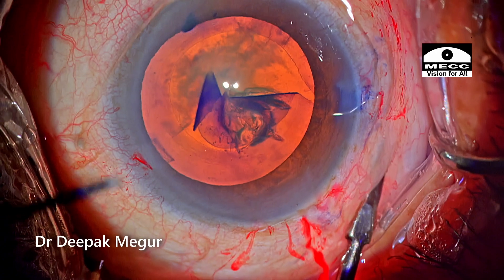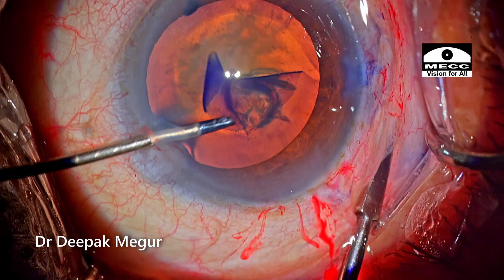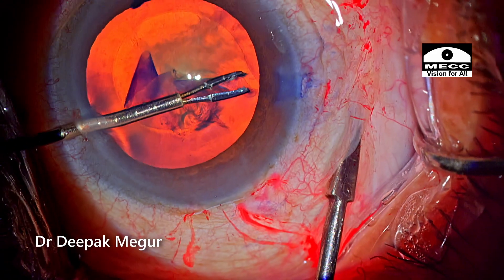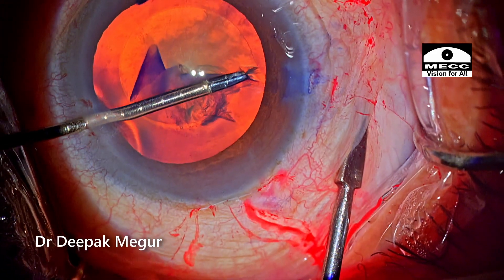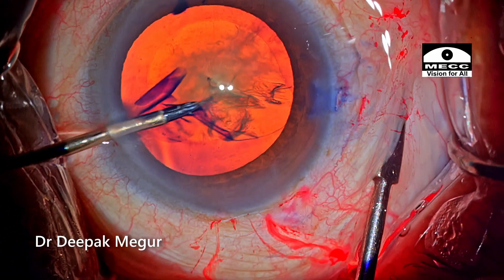You can use a cannula, a spatula, any blunt instrument — just applying gentle pressure over that area. It's going to relax the zonules there. Then using the forceps, the typical little rescue maneuver is done: you fold the capsule flat and pull its end centrally, repeatedly. That's it.